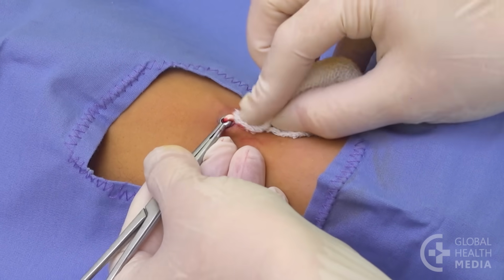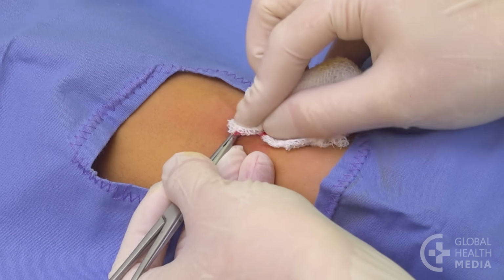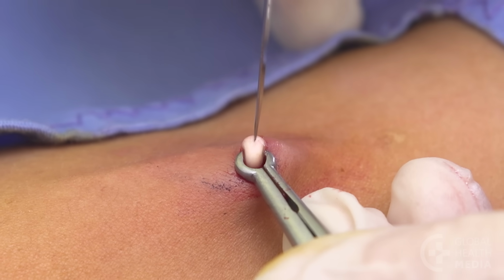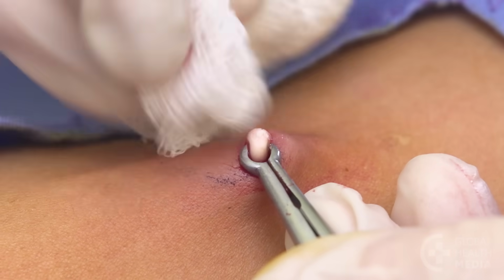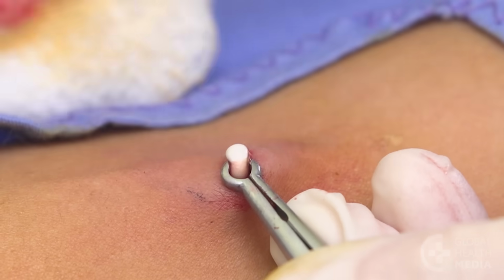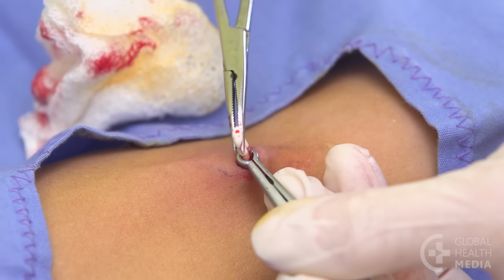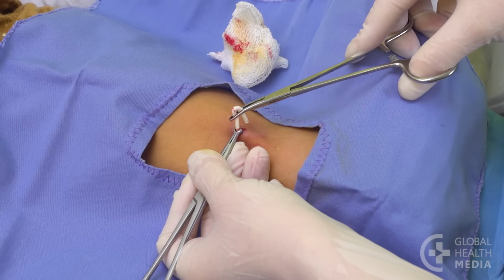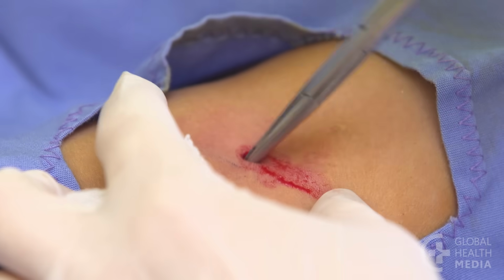Remove the fibrous tissue coating the rod by wiping with gauze and carefully nicking it with the blade. Using curved forceps, grasp the rod and pull it out in an upside-down U shape. Use the same procedure for the second rod.